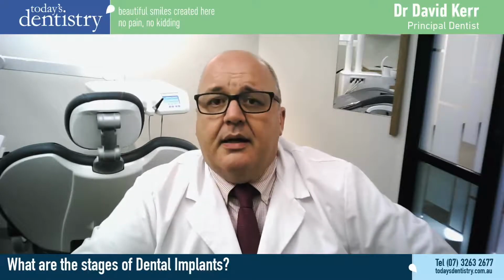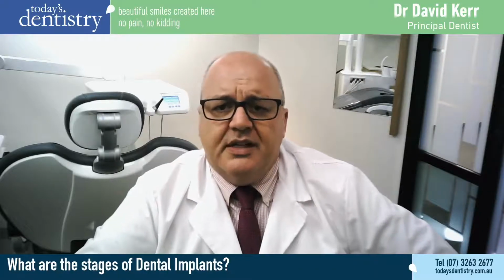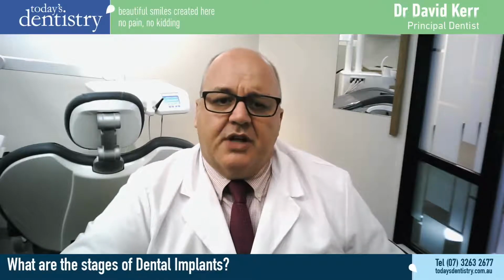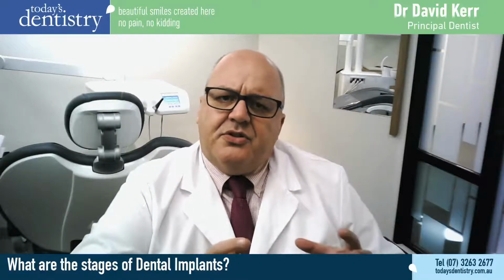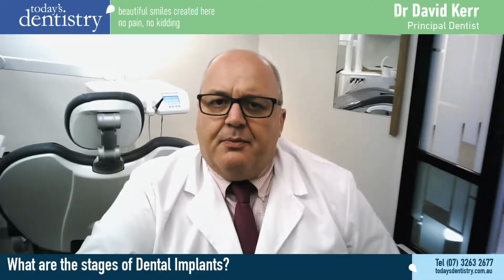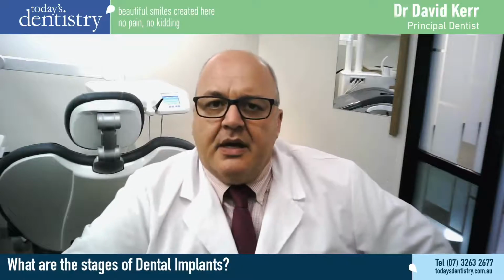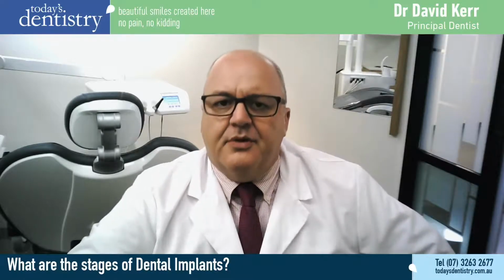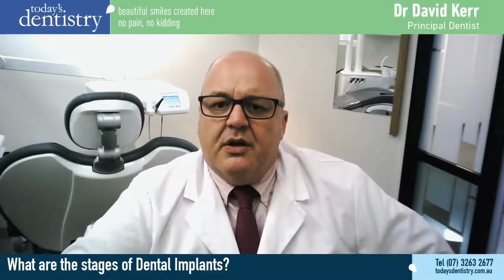Stage 4 is when the implants have been placed, we always need to leave them and let them undergo that process of what we call osseointegration. And that's the process where the implant itself fuses to the jawbone and becomes ready to load. And that process for most cases, not all, but most cases is 3 months. So we want to leave those cases alone for a little while and let them heal before we do anything else. Which brings us then to the 5th stage, which is the restoration.